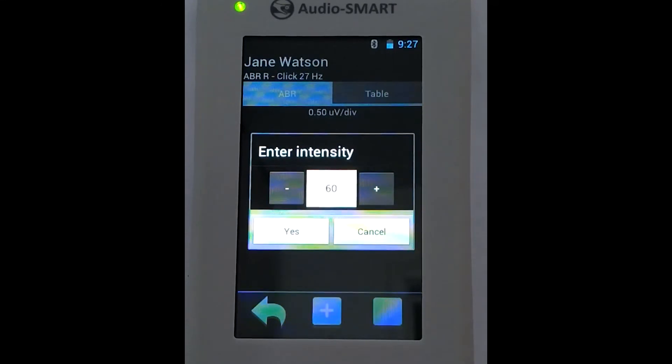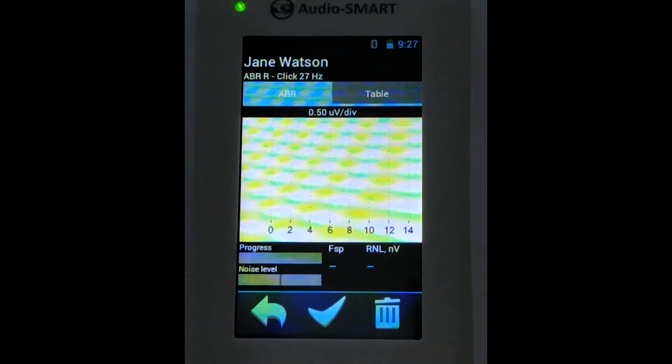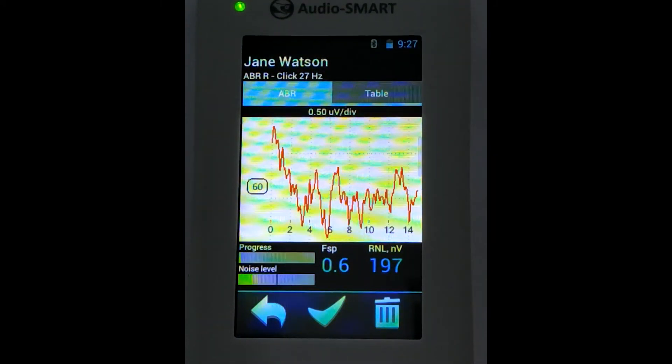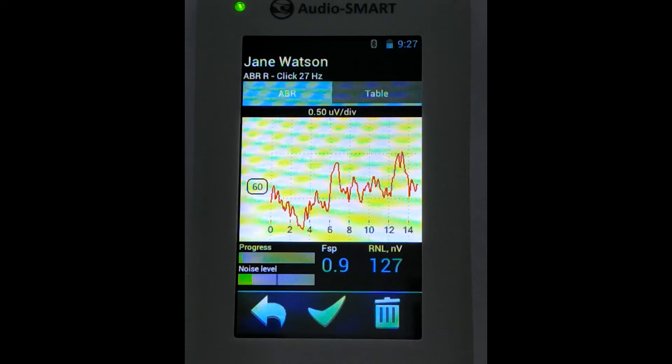The maximum intensity level will depend on the type of stimulator you use — for example, probe, headphones, or inserts. We enter the intensity, press yes, and after that we go to the registration window.